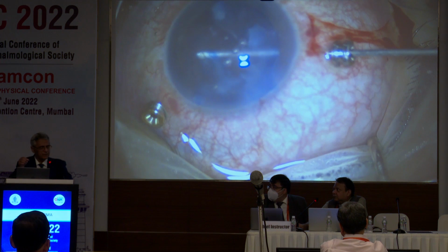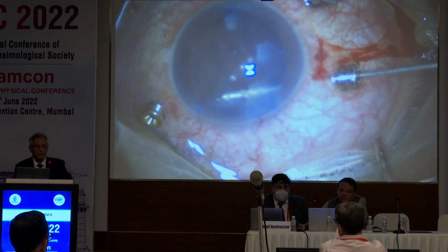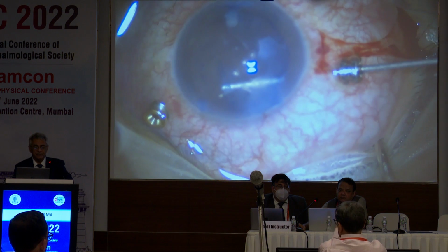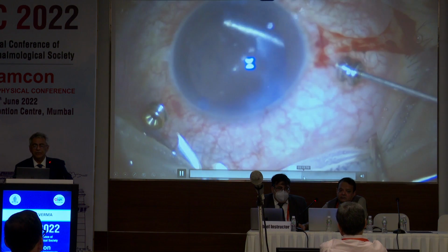But the last message I will just share with you. Then I think we'll discuss this comment. It won't be a phaco probe that you put. It will be a vitrector that you put. Vitrector only, because a phaco probe has different dimensions, and we want thinner ports. It will not cut the vitreous. So I'll just finish. Let me finish. This is a small video only.